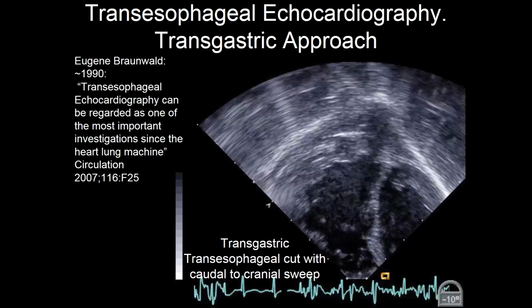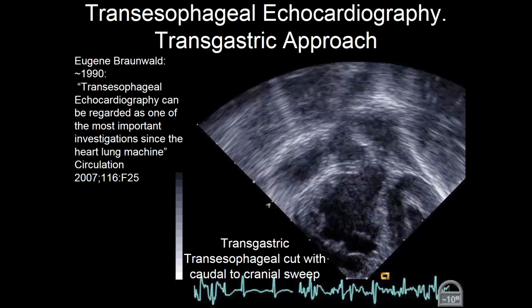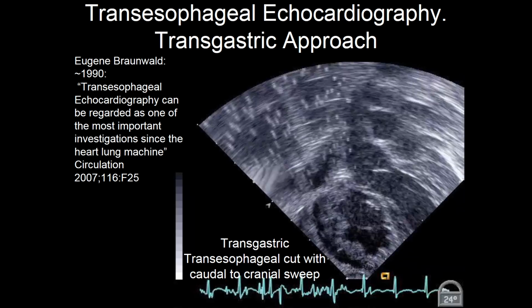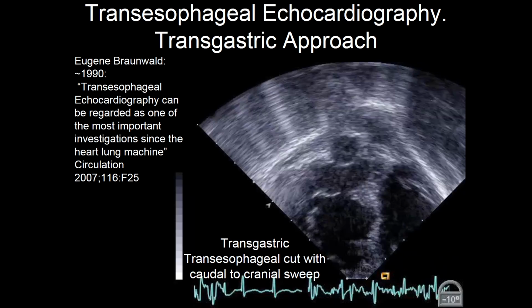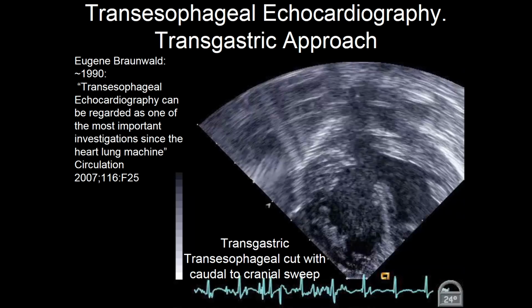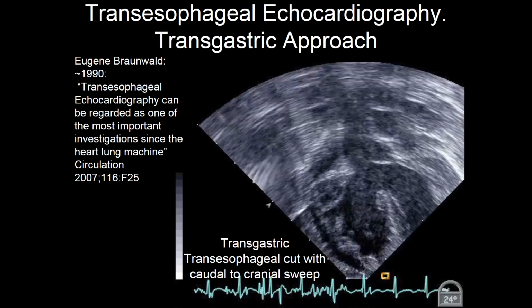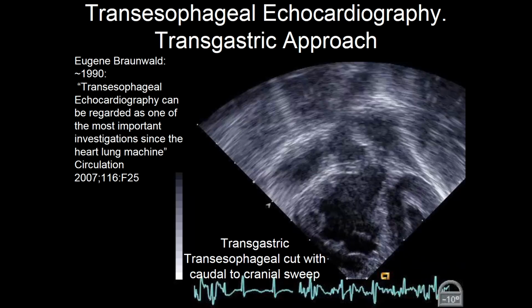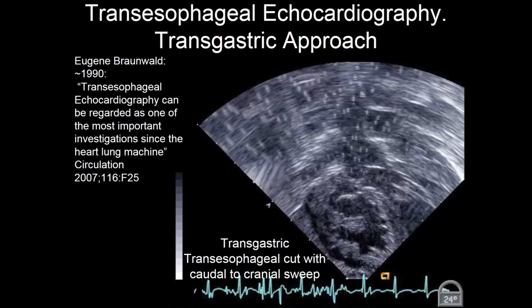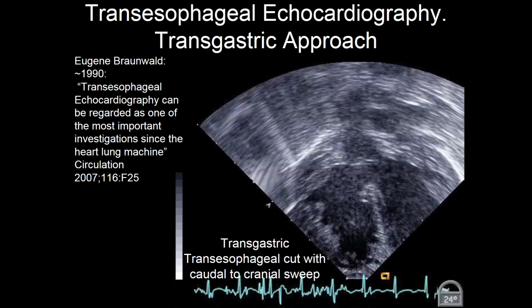And it looks just like the last image that I showed you in the frontal plane. The nagging flashes that you see coming around are due to the miserable surgeon's diathermy, which always interferes with your image. So there you see identically the same thing, the overriding aorta, the narrow outflow tract, and the smallish pulmonary artery.